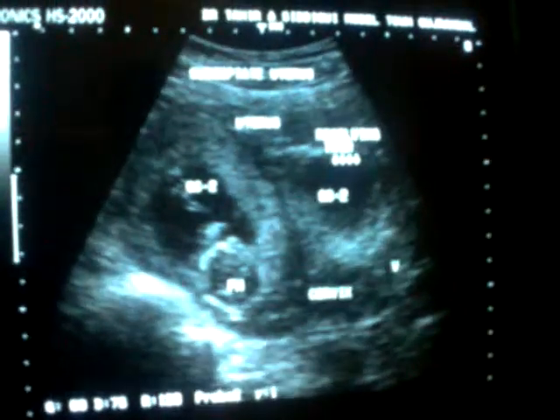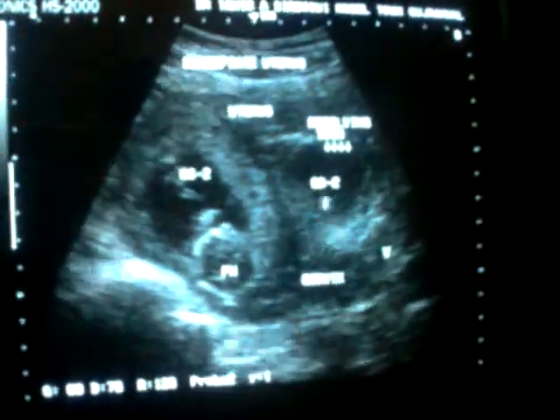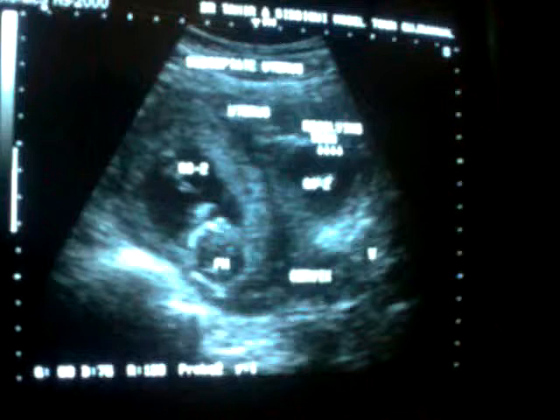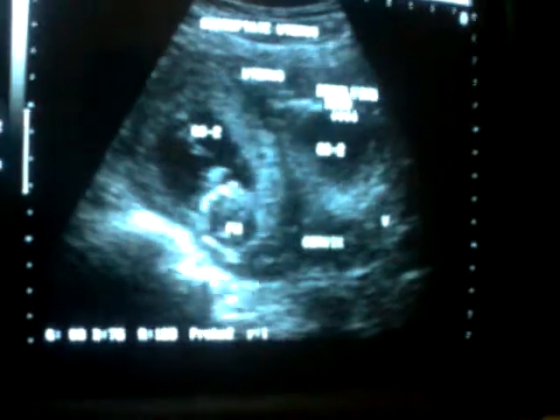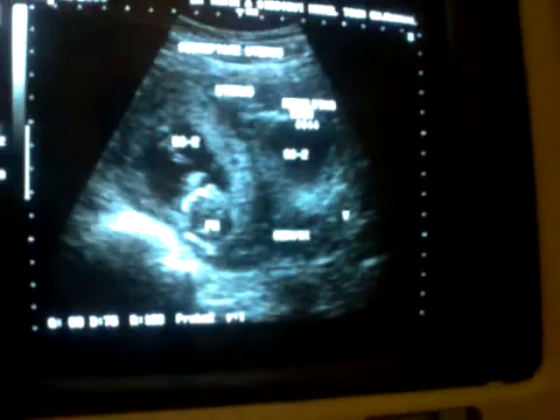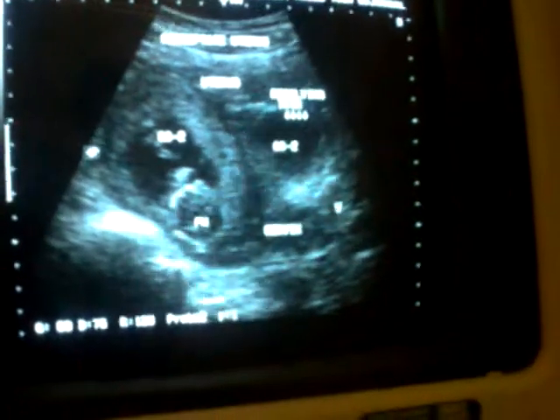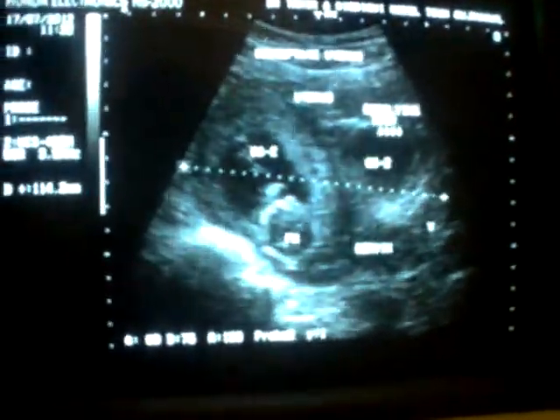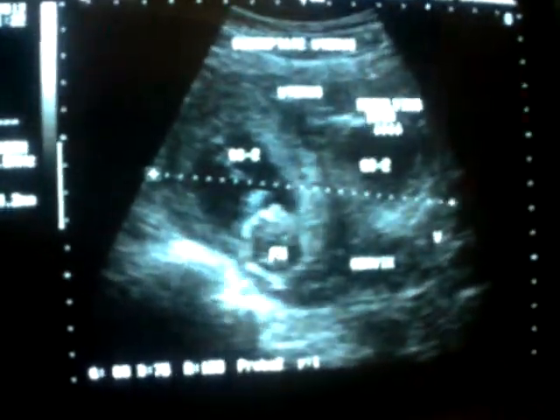So there are two endometrial canals, and in this endometrial canal there was also a pregnancy that is resolving now. This is a resolving twin. It has resolved completely in this endometrial canal, whereas in the second one we see the fetal head. As we perform the ultrasound, you will see that one sac is empty and one sac has a fetus which is active and normal, alive.